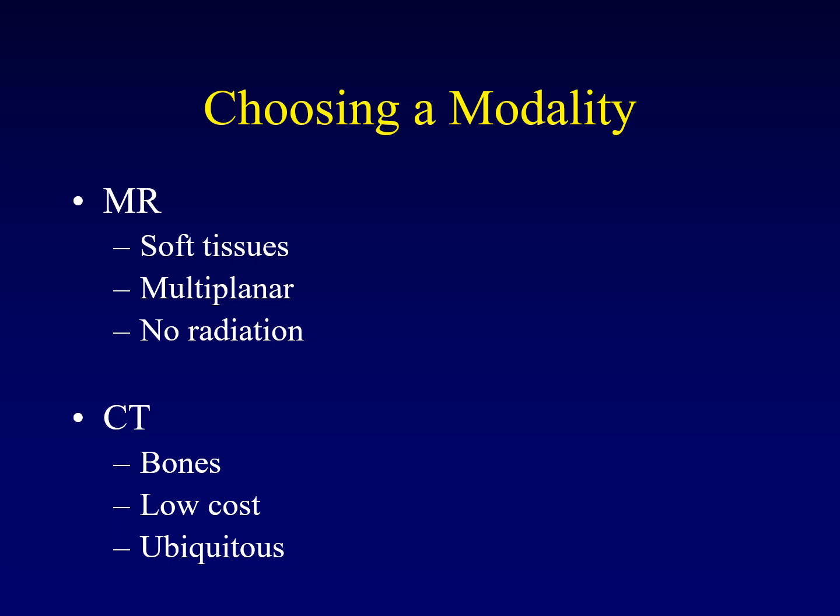Now, so what are the advantages of CT? Well, CT does a better job on bones as opposed to soft tissue. CT is of much lower cost than MRI, less than half the cost of an MRI. And CTs are ubiquitous. They're everywhere. It's so easy to get a CT. If you come into the ED, there are multiple CT scanners in the emergency department. You can't swing a dead cat at UPMC without hitting a CT scan. They're everywhere and they're easy to get.